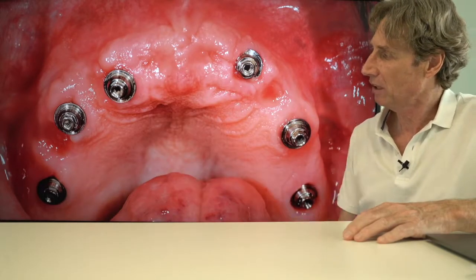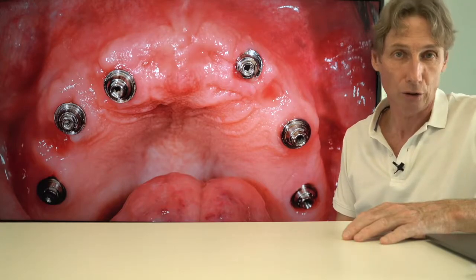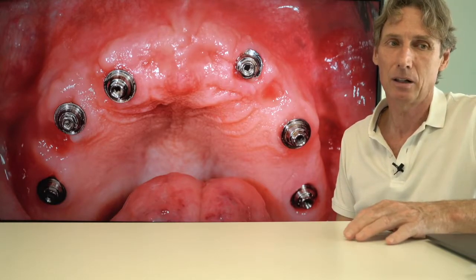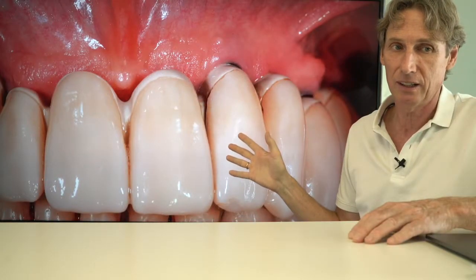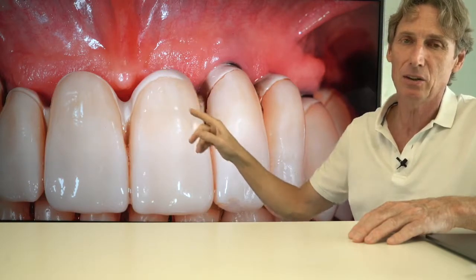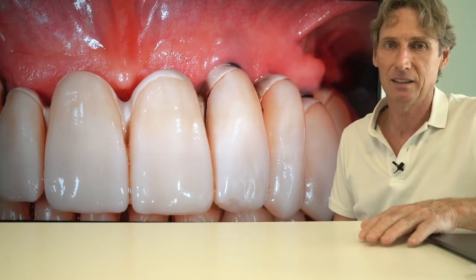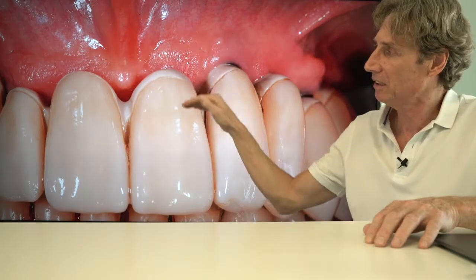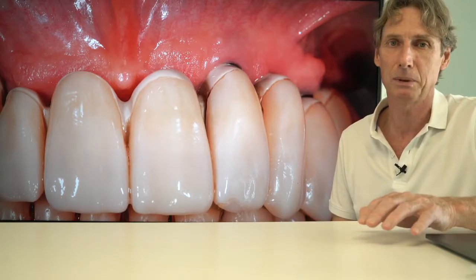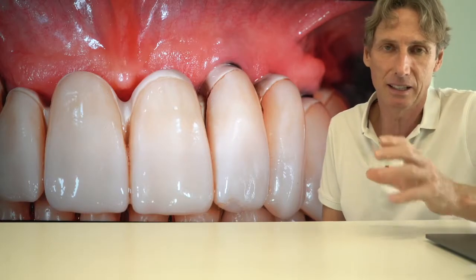So here you see the situation after 4.5 years with absolutely healthy and stable soft tissue, and if we have stable soft tissue we also will find stable hard tissue beneath. The situation 4.5 years later, so that's absolutely stable, okay? So we can leave PEEK here, or we can cover it with the ceramics. You are free, and these design details, the patient is not demonstrating this part while he is laughing. He wanted to be the solution with the best biocompatible and cleanable solution.